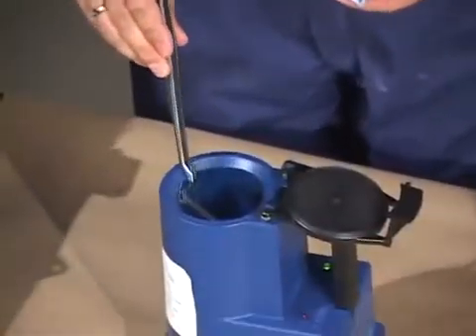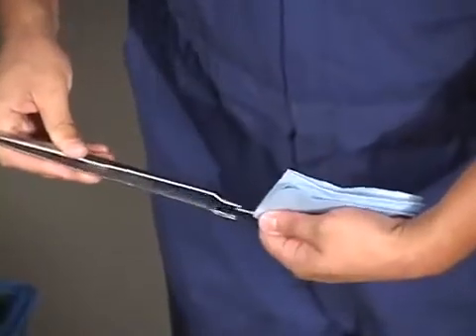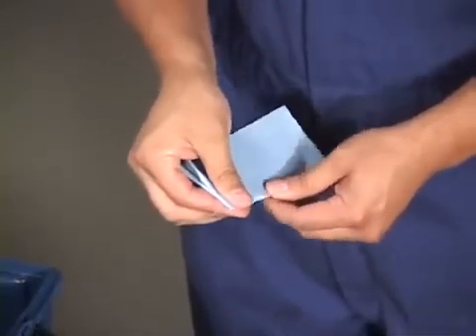With the tweezers, remove the straw from the thaw box and place it into a folded paper towel. Completely dry the semen straw because water is lethal to sperm cells. Always protect semen from exposure to sunlight and from cold shock.